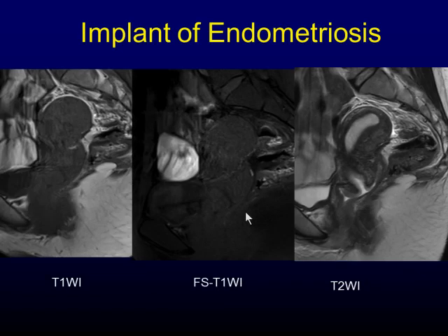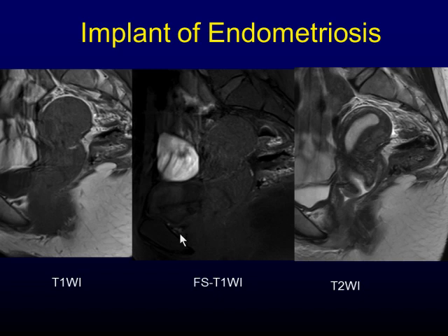Implants of endometriosis represent small areas of hemorrhage. These implants can be visualized on T1 with fat saturation. In this case, strong adhesion is noticed at the posterior uterus. The hemorrhagic region is difficult to detect on T1-weighted image but is easier to see on T1 with fat saturation.